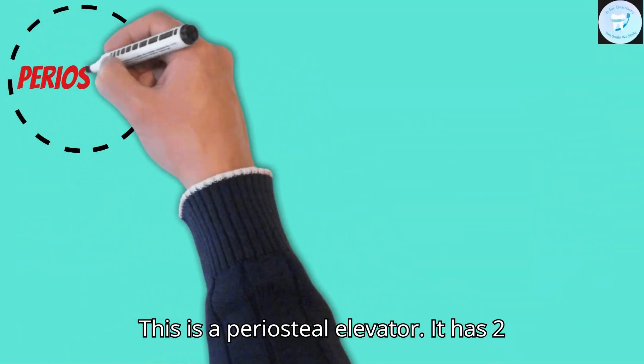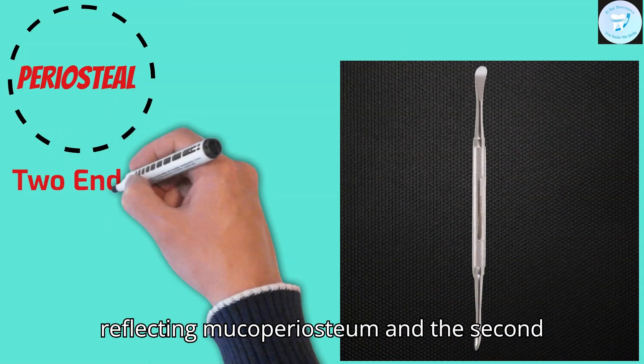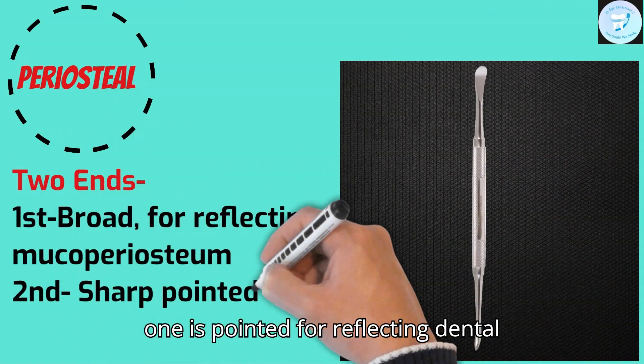This is a periosteal elevator. It has two ends: the first is broader for reflecting muco-periosteum, and the second one is pointed for reflecting the dental papilla.